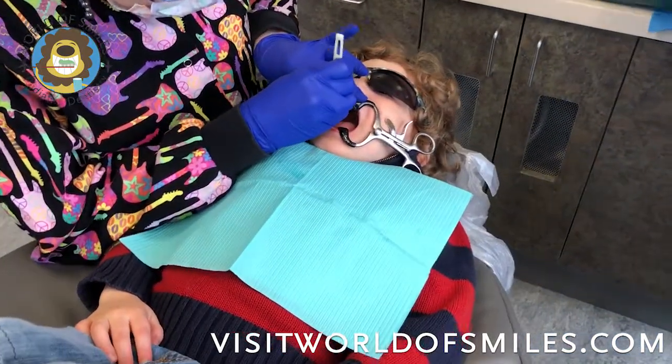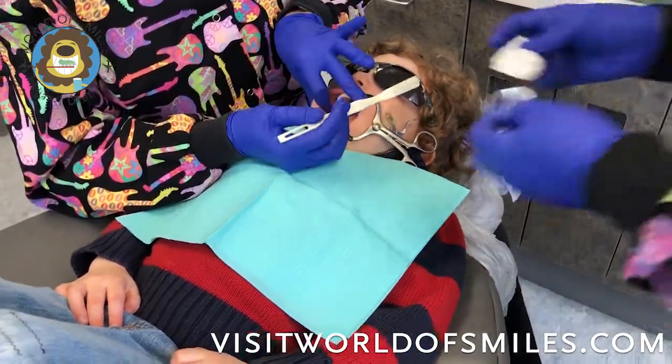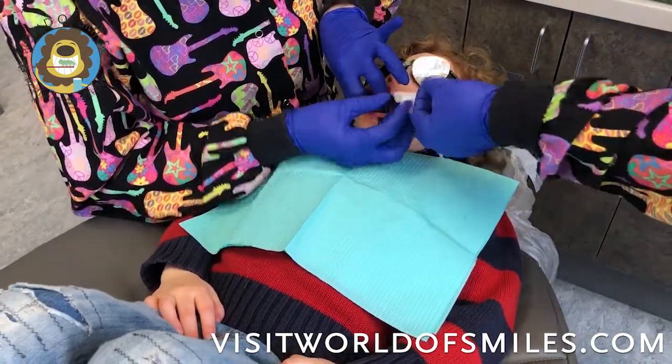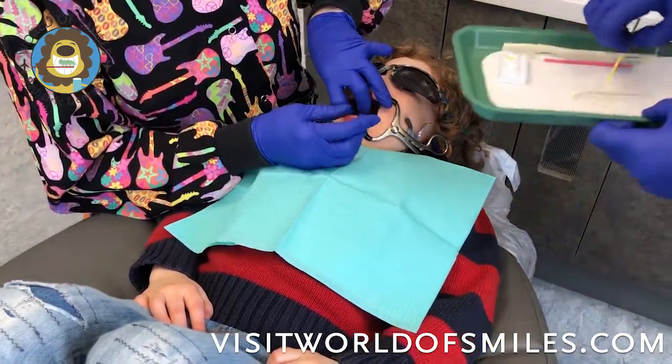First, placing the mouth prop, and then we'll go ahead and do some brushing of the area that we'll be working on. Today we are going to be addressing cavities on teeth number A and B. Clean off the area and then dry it, and then you want to make sure that you isolate it so you can use a dry angle.